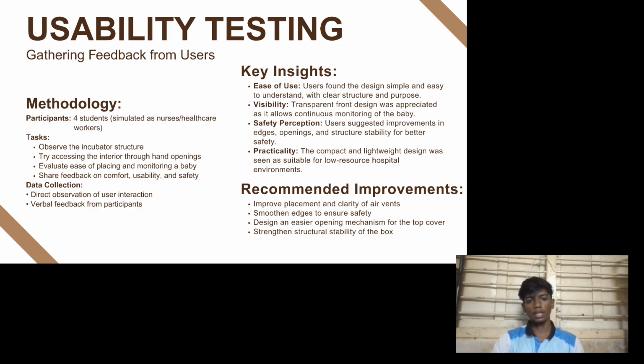Let's see the methodology. Let me explain how we conducted the testing. We had four participants, and they acted like nurses or healthcare workers. Then we gave them some tasks. First, we asked them to observe the incubator structure. Next, they tried accessing the inside through hand openings, like how they would handle a baby. Then we asked them to check how easy it is to place and monitor a baby inside. And finally, they shared their feedback about comfort, usability, and safety.